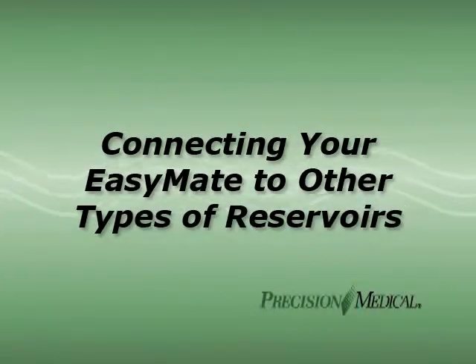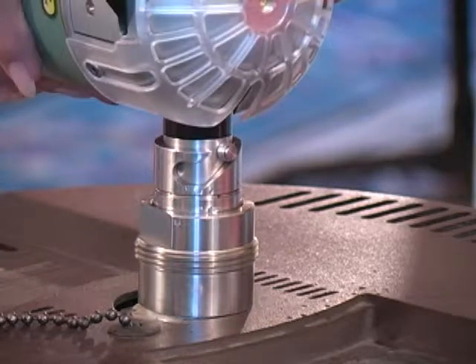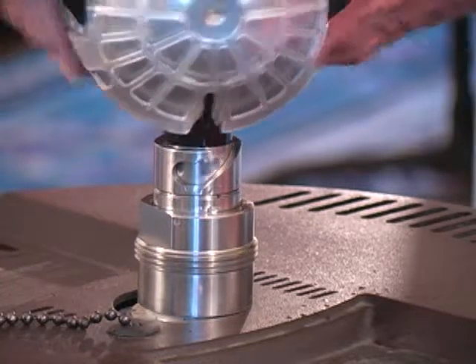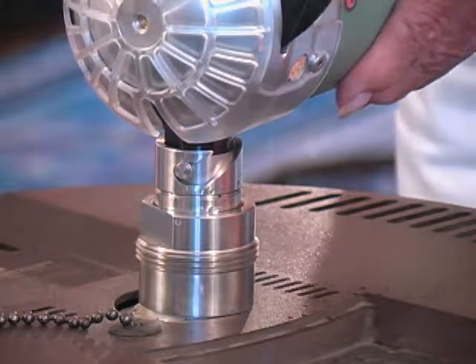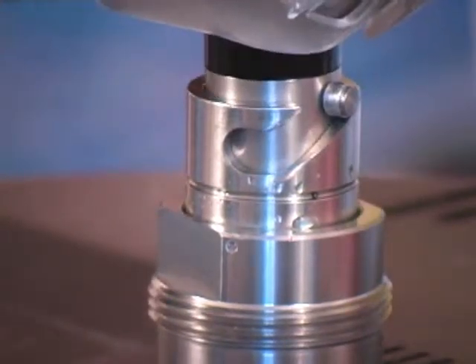Depending on the type of reservoir provided, the portable unit can connect in one of two other ways. Some units will have a pin on the fill connector. Carefully line up the pin on the fill connector to the slot on the base unit and connect the portable by rotating clockwise about 90 degrees. After filling the unit, disengage by rotating counterclockwise 90 degrees.